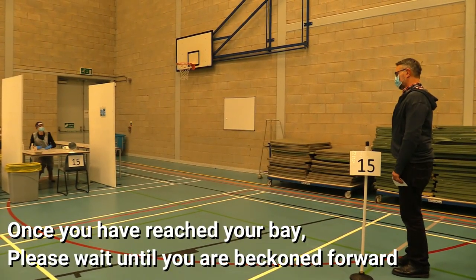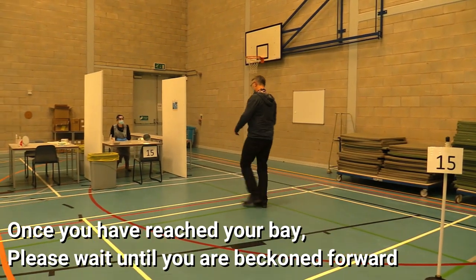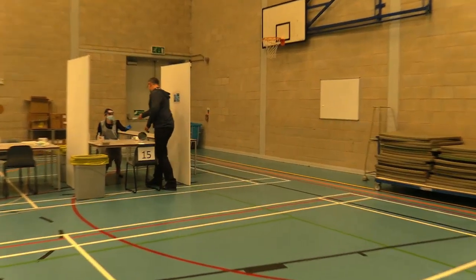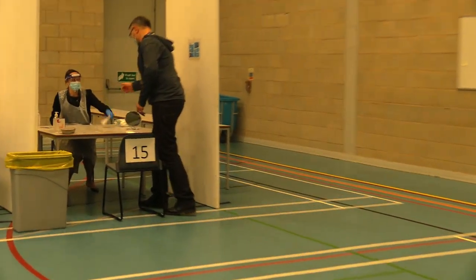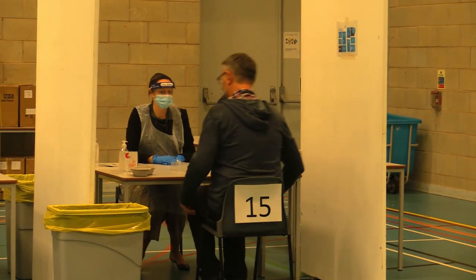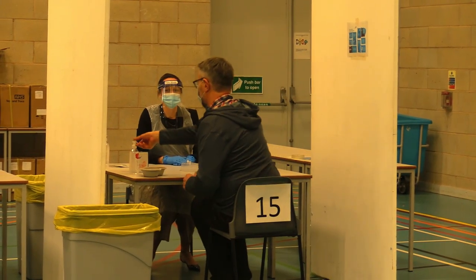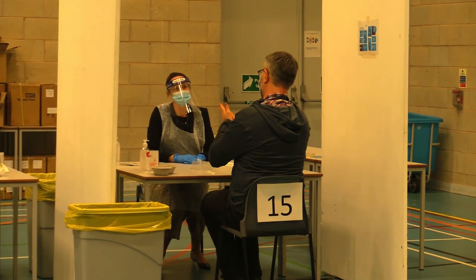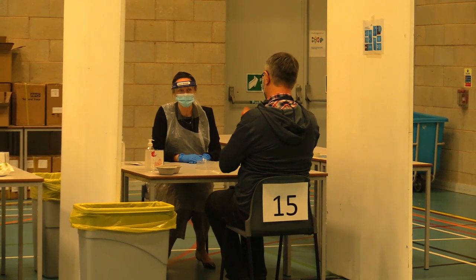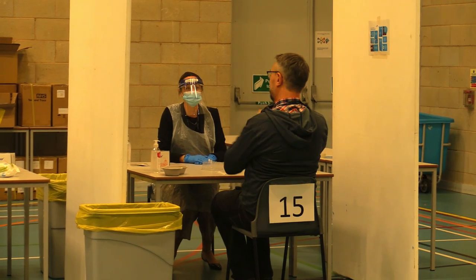Hi Ben, do you want to come forward please? Can you pass me your card? If you can sanitise please. You may need to blow your nose. You can take the mask off now.